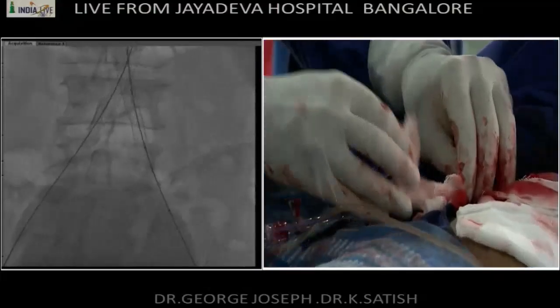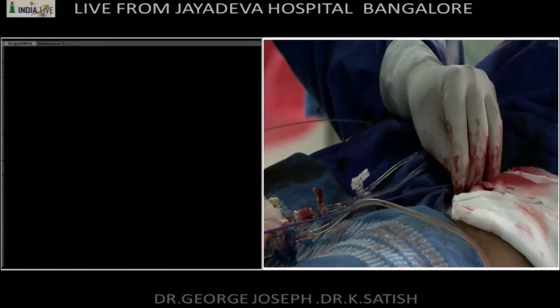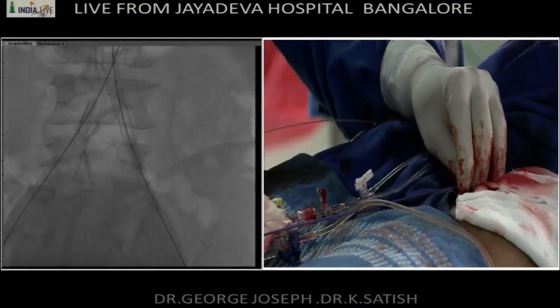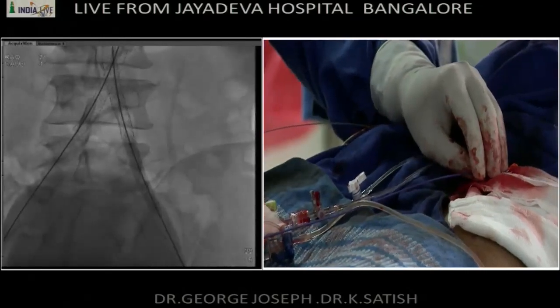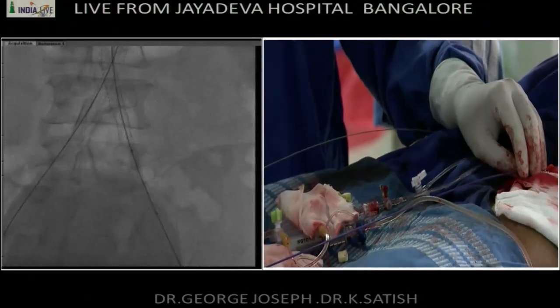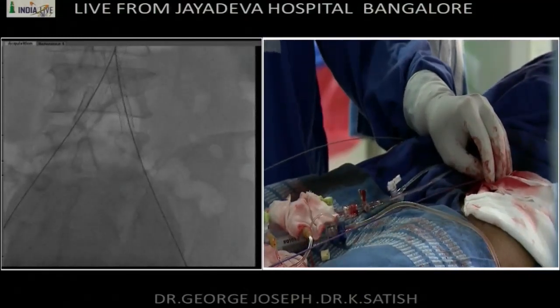The self-expanding stent with the 7 millimeter balloon expanded stent. Do you think they can really oppose these stents? Sorry, sir? You have a balloon expandable stent which is larger in diameter higher up, and then you have a self-expanding stent which is smaller in diameter, which now gets telescoped in a larger diameter. So there will be a space between that balloon expandable. I think they have a bigger 8 millimeter and a 6 self-expanding.